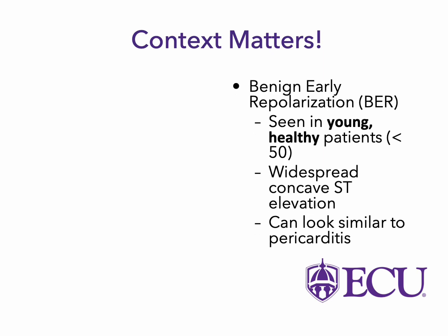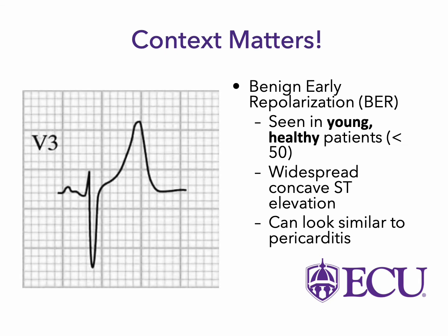So benign early repolarization is a very common STEMI mimic that we often see either in the emergency department or in the field that can look like a STEMI but does not qualify as a STEMI. So this is typically seen in young, healthy patients, so they'll be less than 50.